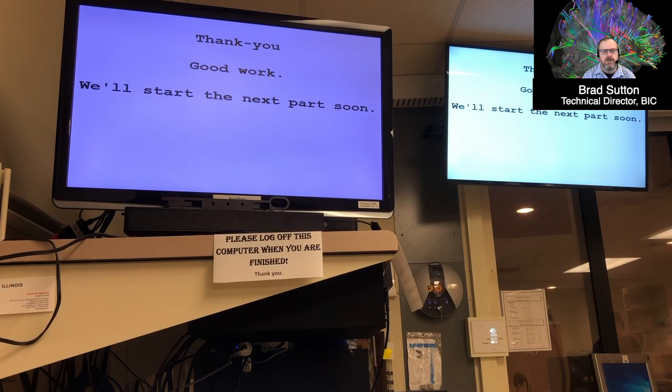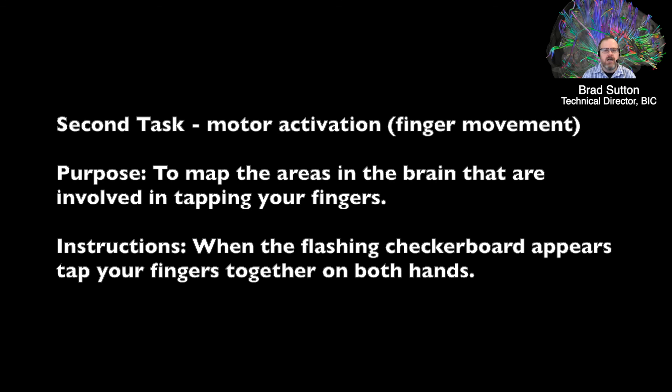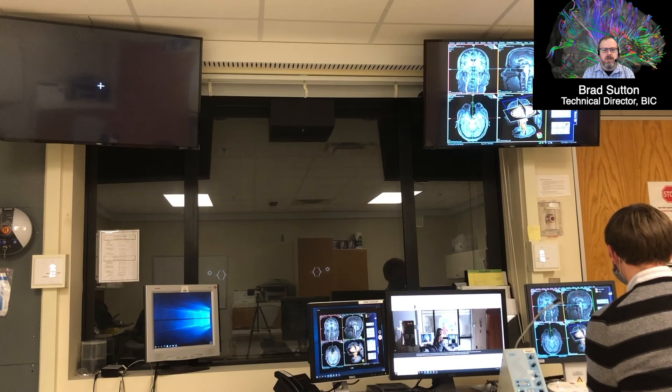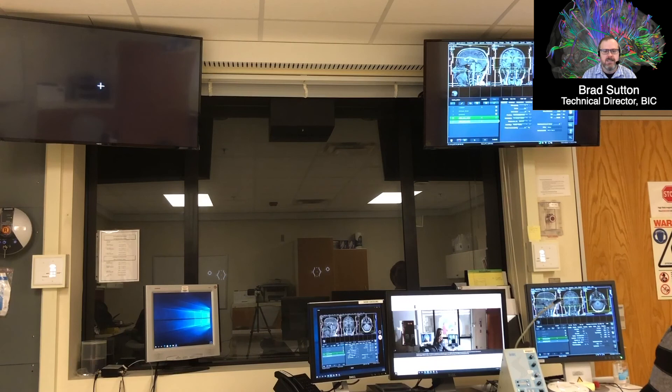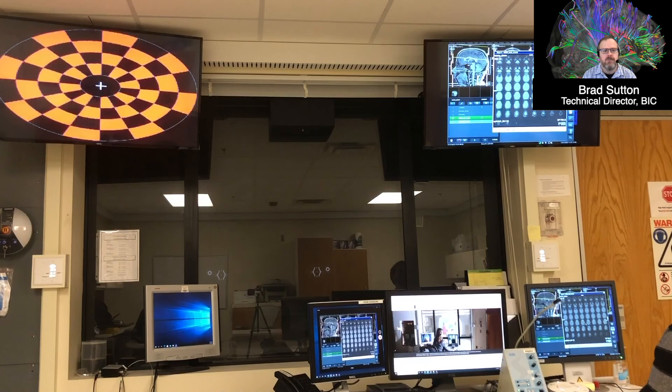Aaron is showing that we can watch some results in real time as they come out on the scanner, seeing activity appear as we scan. Now we're going to do a second task: finger tapping. When subjects see the flashing checkerboard, they tap their fingers, resting in between. We have to be very careful — any motion in the image will show up as activation, so people must sit very still with their hands supported so they don't need to reposition to tap.